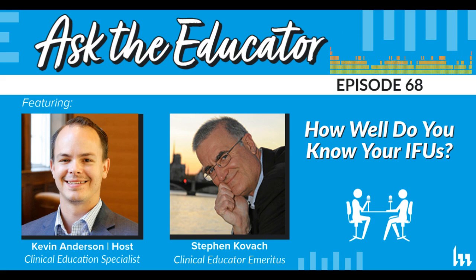And if we get people to understand that, maybe we won't have these errors that you and I find, and all our educators, when we go in to do these tray audits. We find from dirty instruments to broken box locks that these are sterile trays that we're opening up. And the IFU says you should inspect it. So how could somebody miss a broken crack, or do they not have the right microscope or magnifying glass, you know what I mean? It's not a simple one-stop answer. It's many things, right? It is many things.